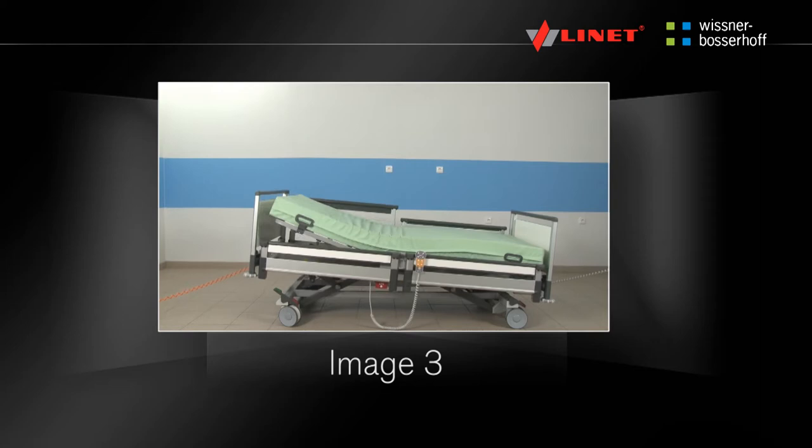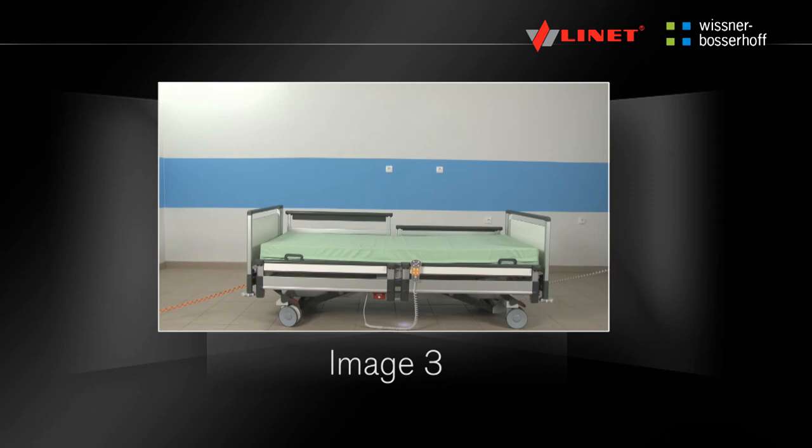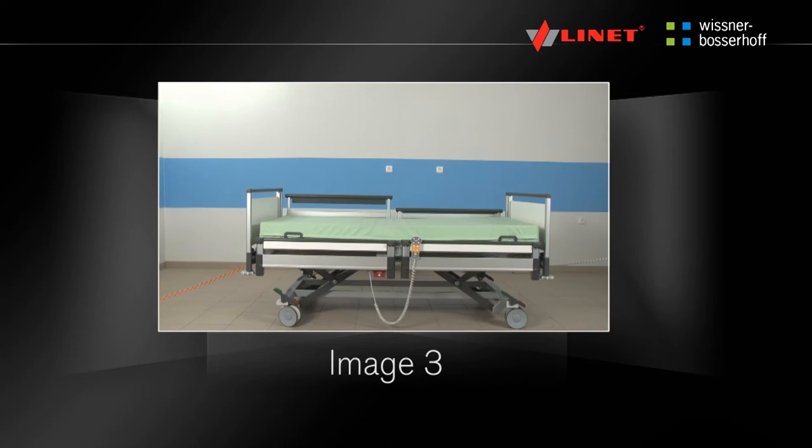The fully electrically adjustable hospital bed Image 3 is designed for standard wards. This video manual is designed for the practical training of operators in the bed functions. It does not replace the instructions. Always read the instructions.